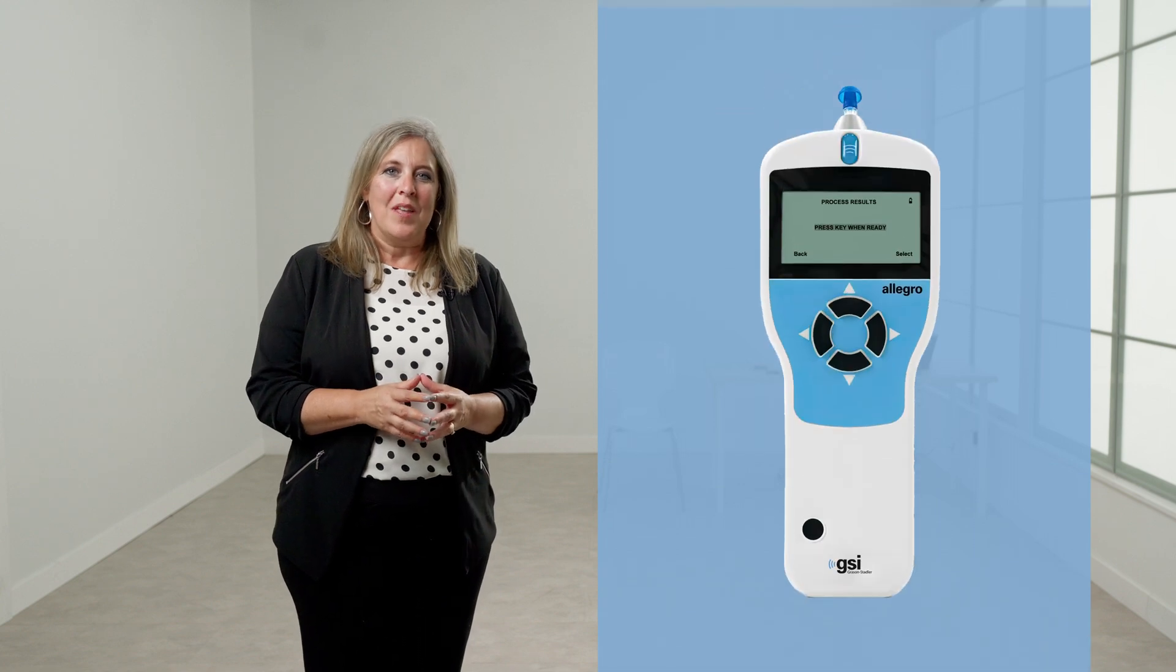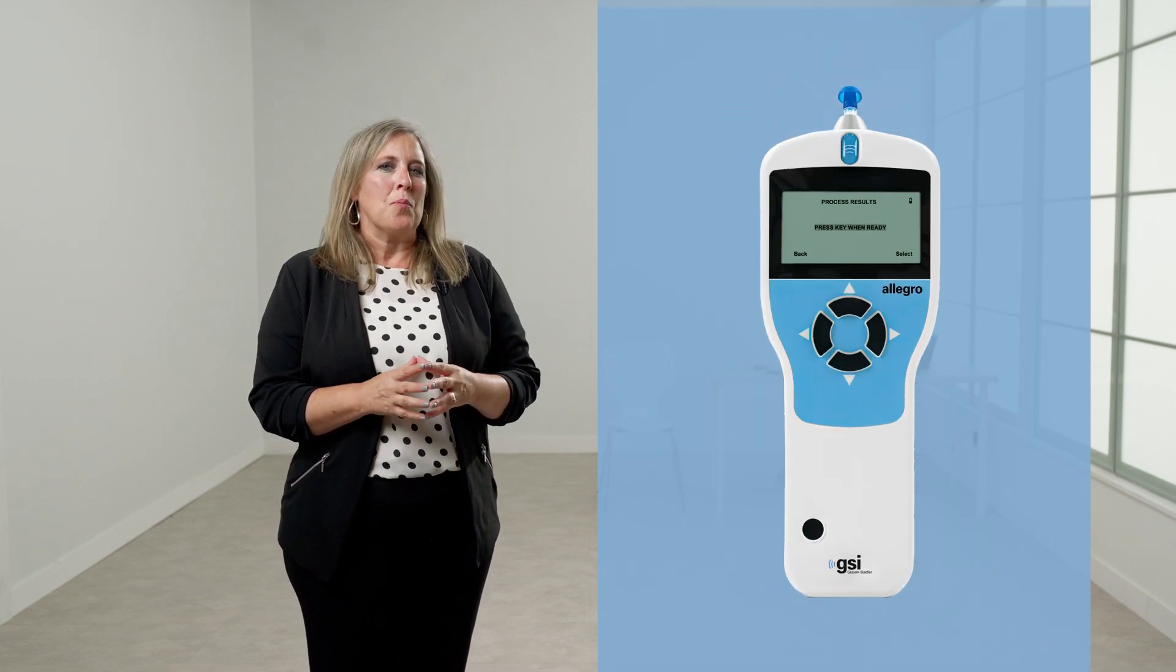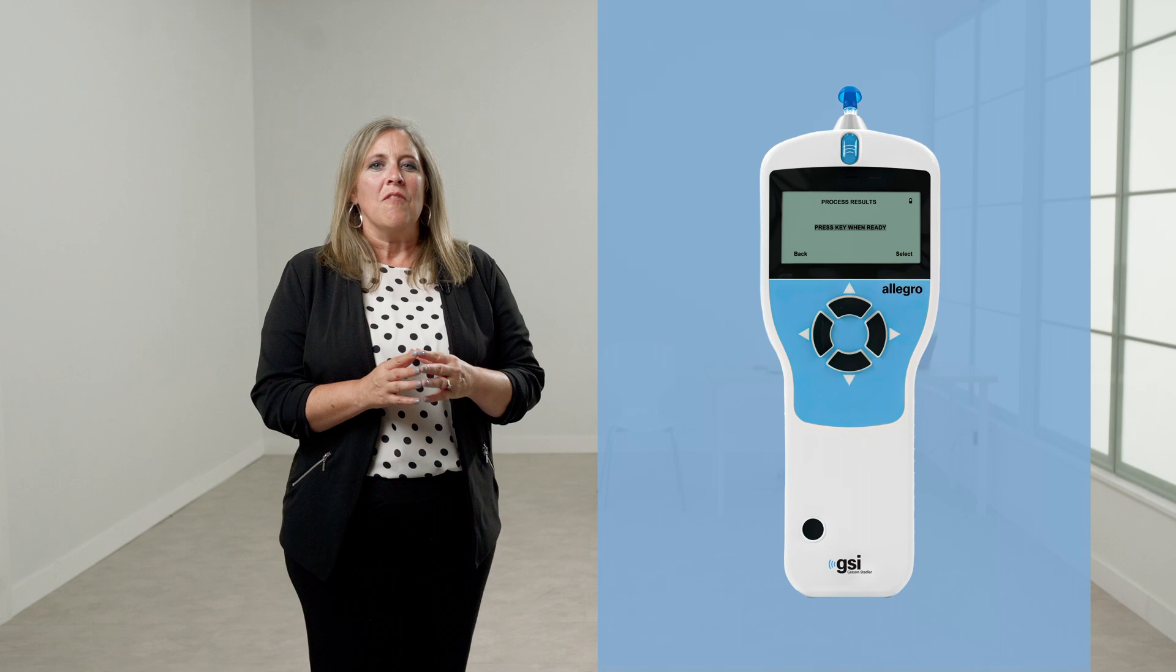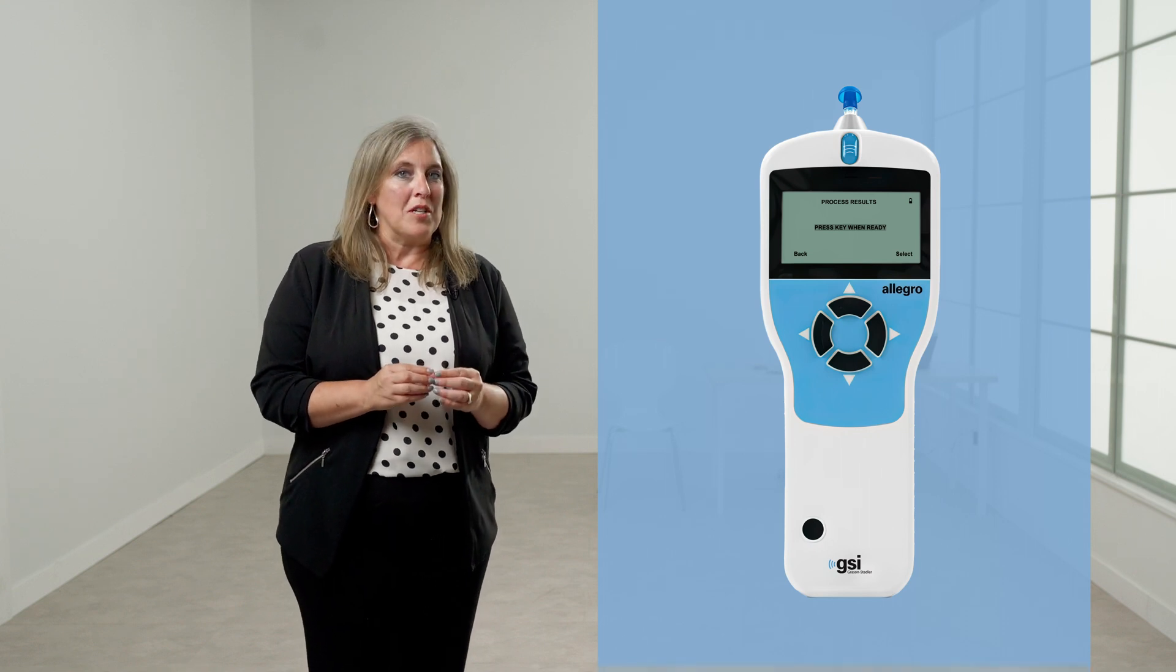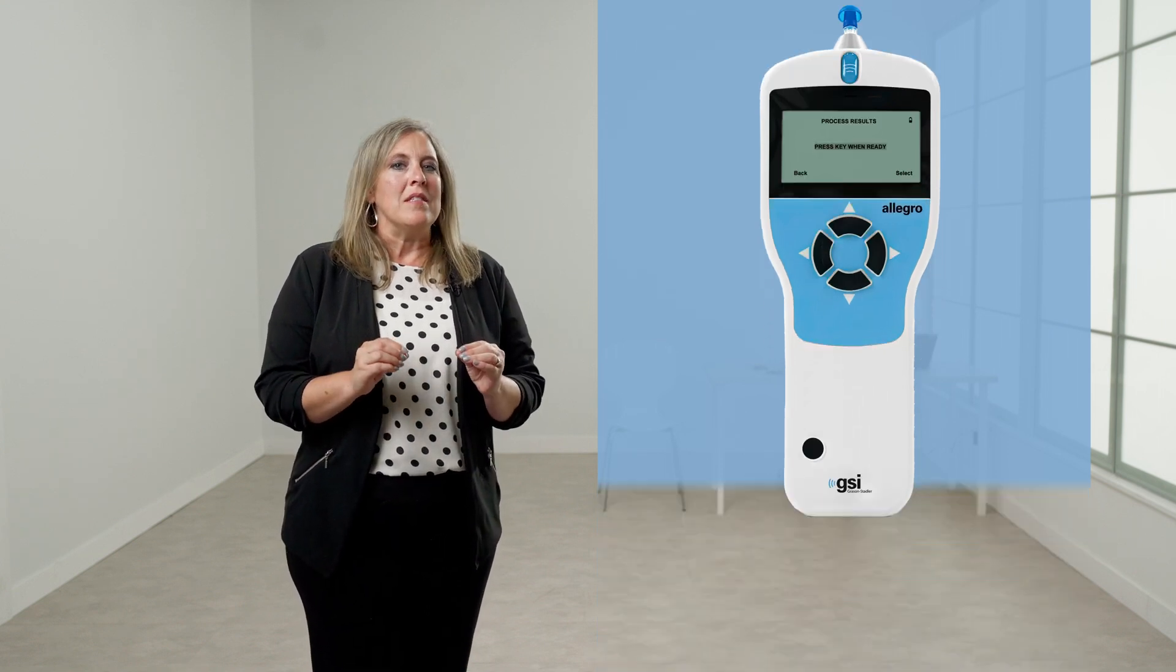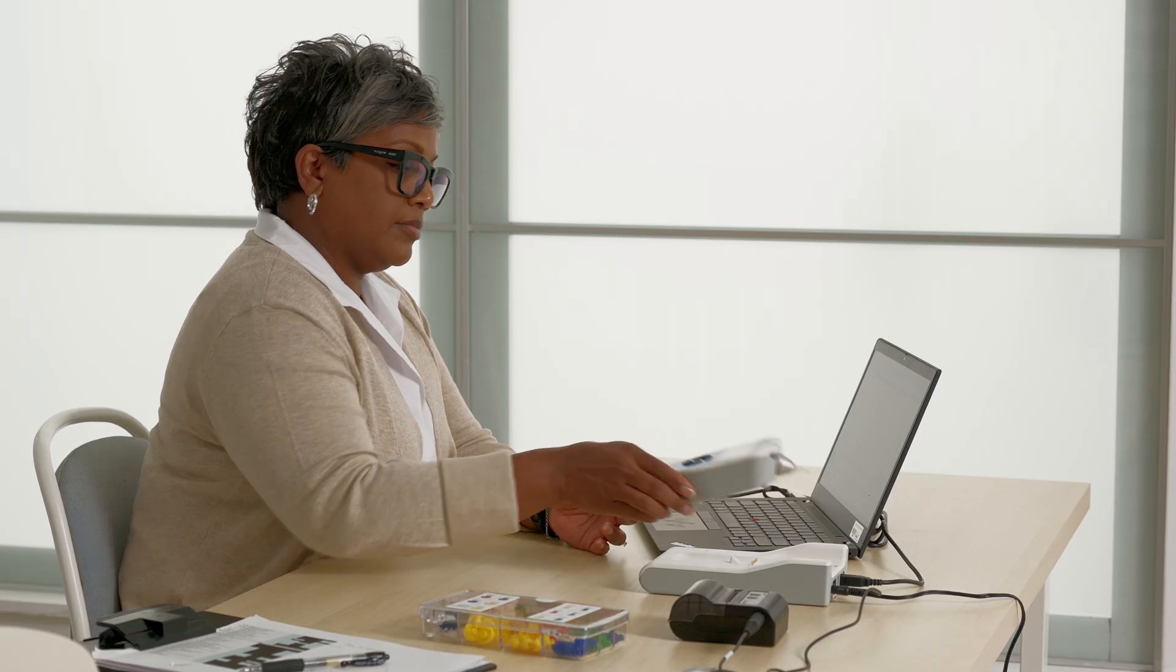When the test is completed and the results are accepted, the process results menu will be displayed. From here, it is possible to print or save the results, view the test again, or return to the main menu. Please note that the results of the last test performed remain available even if the Allegro has been turned off. However, the results of the last test will be erased as soon as a new test is started. Test results should be saved to the internal database or printed to ensure that data is not lost.